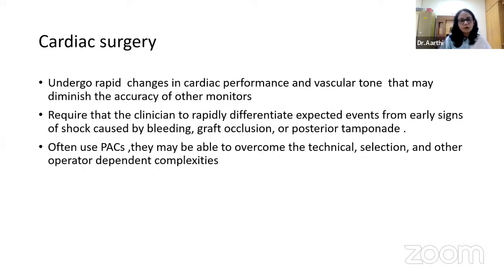A few words about hemodynamic monitoring in cardiac surgeries, because cardiac surgery patients undergo rapid changes in cardiac performance and vascular tone that may diminish the accuracy of other monitors, and it requires the clinician to rapidly differentiate between early signs of shock like bleeding, graft occlusions, and tamponade. These are the areas where PACs play a major role, where technical and selection criteria can be overcome because they are used very frequently and clinicians are more familiar with pulmonary artery catheter techniques.